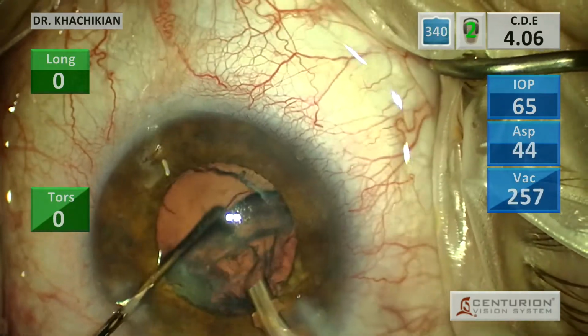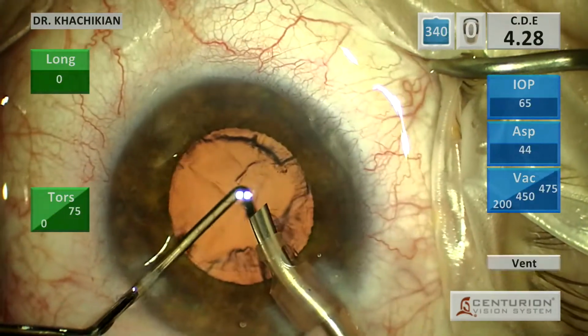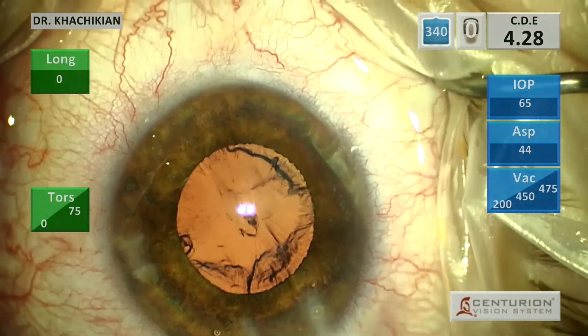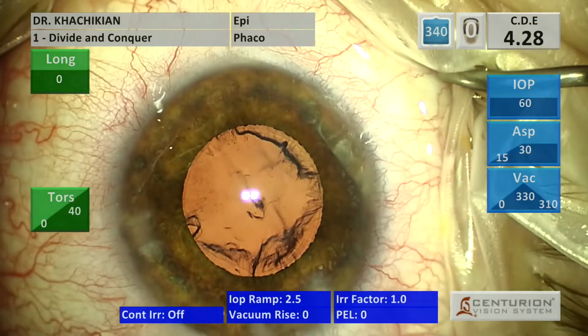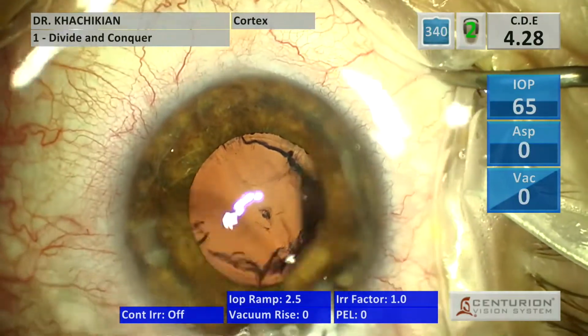Now we are removing our epinucleus. Some people believe it's kind of a waste of time to remove the epinucleus, but I do think it protects the capsular bag until you remove the central nucleus, and then the epinucleus comes out fairly easily. Now that we've got our epinucleus removed, we're going to use the IA handpiece to remove the remainder of the cortex.